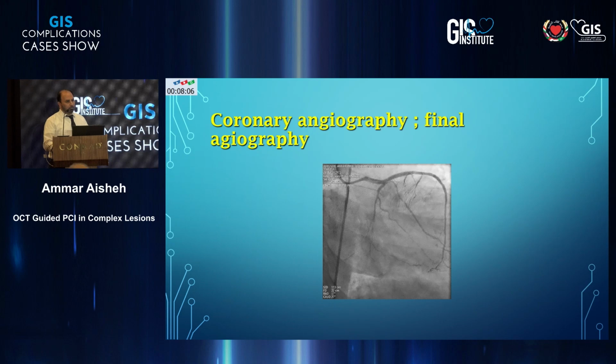And there have been multiple publications so far on drug-eluting balloon, all showing very good results. Now, there's a center in the UK that has been using this for many years, and they published this series recently, and in all the cases, acute vessel closure was less than 1%. So it's that mental prep, or how we're used to it. You have to see that perfect appearance with the stent, and this is what we need to get away from.